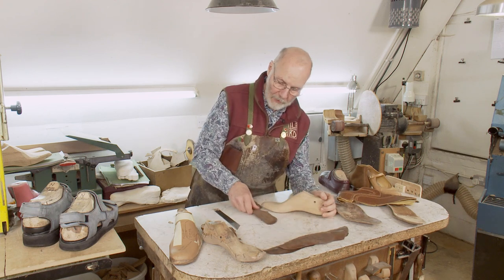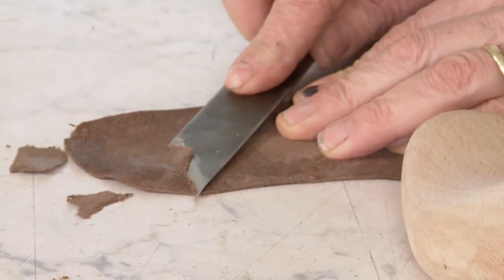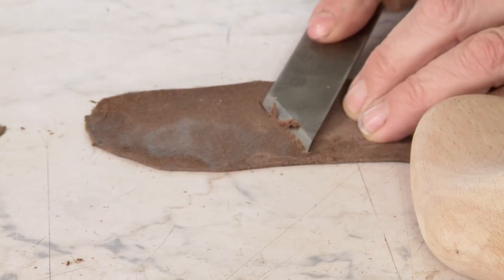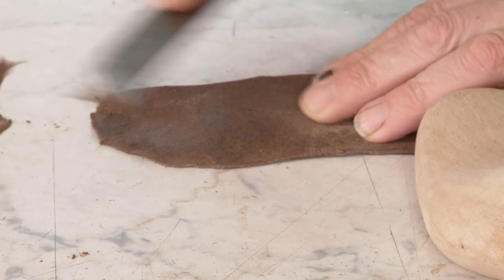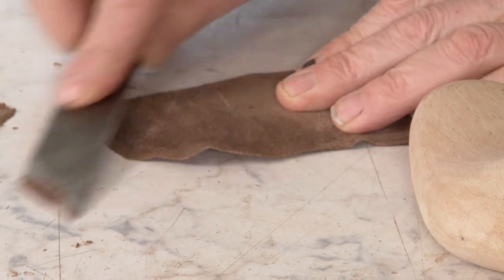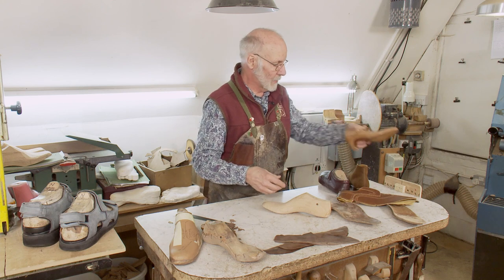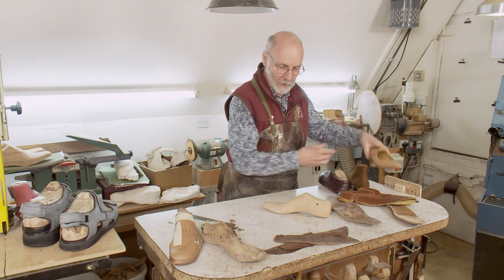Each one of these stiffeners can be made very light. If it's too heavy, I can thin it down with a sharp knife like this and get the weight down. Stiffeners are quite a big contributor to weight. Let's see how light that shoe is — and yet it's still got a long stiffener in it.